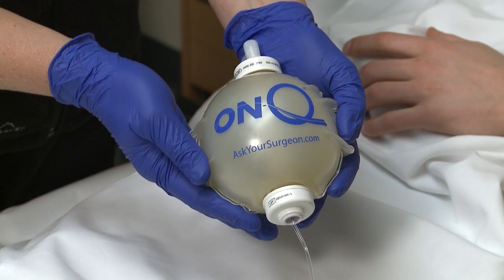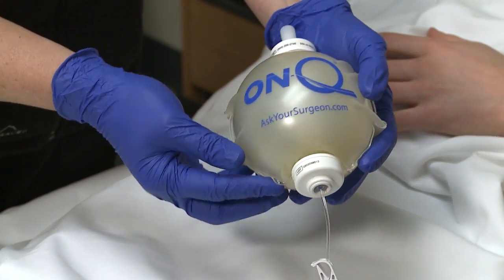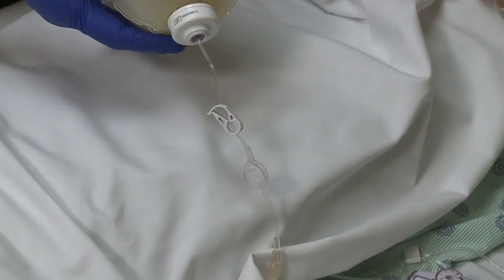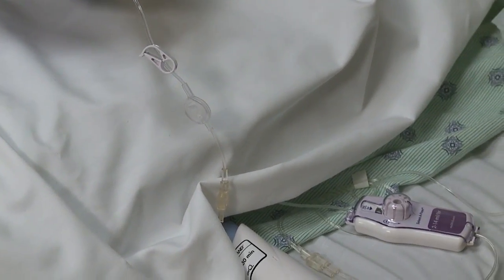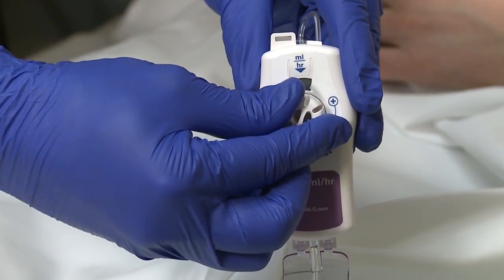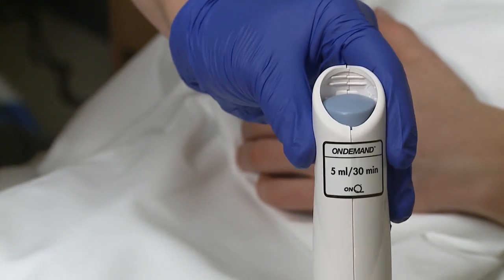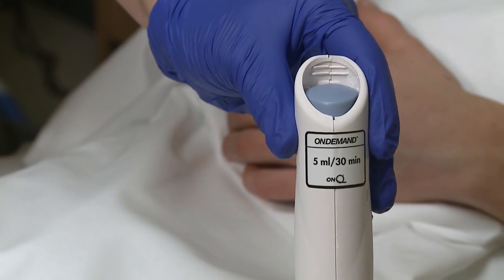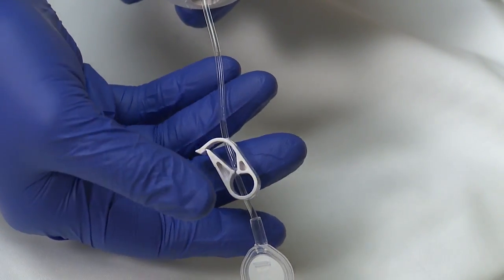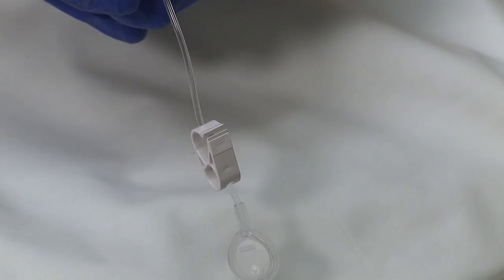The OnQ Pump is basically a local anesthetic-filled balloon with tubing that connects to the flexible plastic catheter in your body. It only contains numbing medicine. There are no narcotics in the solution. It has a dial that controls the infusion rate, as well as a squeeze button that allows you to give yourself an extra dose of numbing medicine as needed for breakthrough pain. There is also a clamp that you can use to shut it off completely if wanted. However, this is usually just left open once it's connected to your catheter.